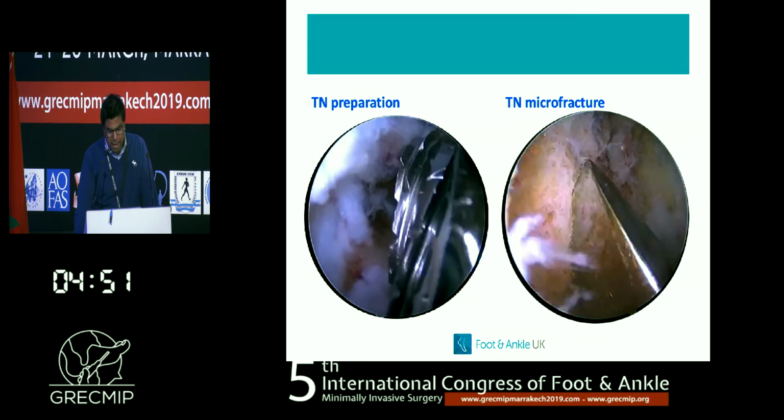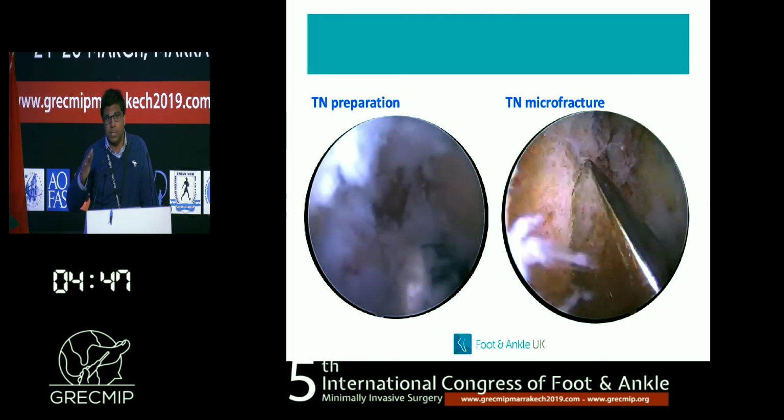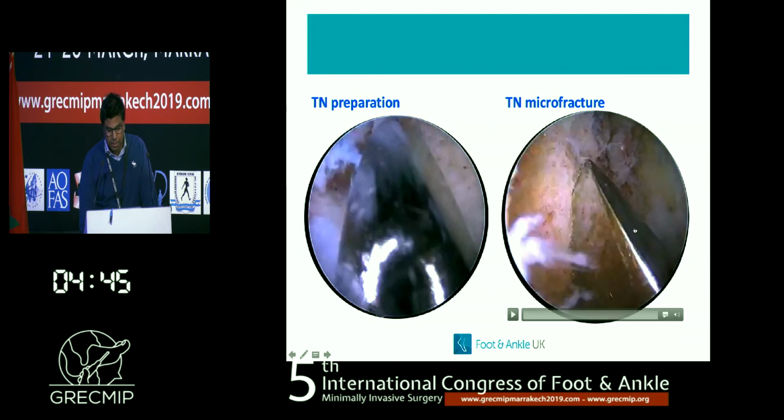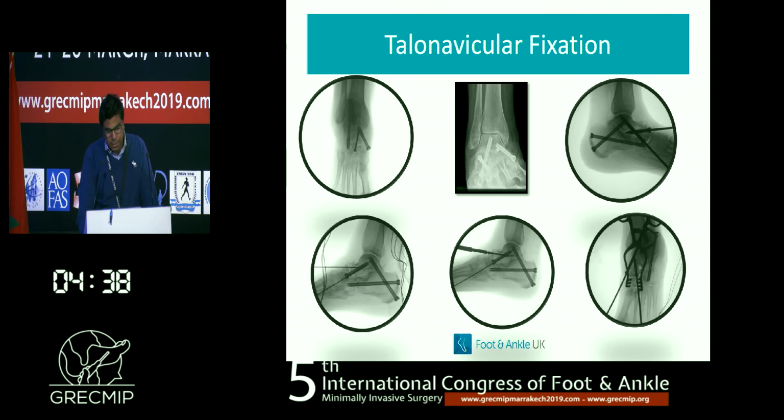Once this is prepared and mobilized, you start clearing the joint, and you try to do this in a concentric fashion that maintains the anatomical alignment, and then finally I do a microfracture through that area. I use standard screw fixation, but as we'll come back to, the lateral talonavicular screw was frequently malpositioned in my series of patients, and so I do a mini open approach for this now.